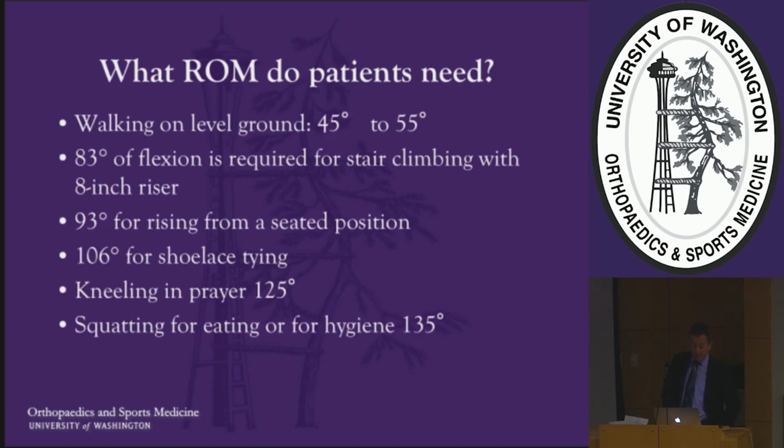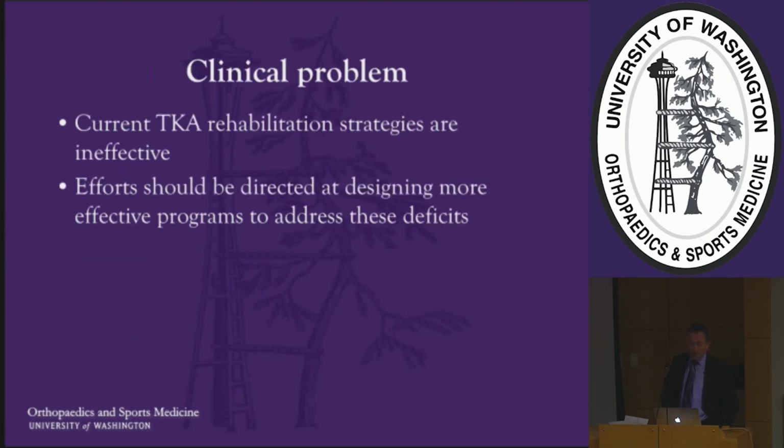Range of motion does make a difference in terms of activity, and that's a reason it's important to check. But the problem is that we don't know what patients are doing after they've left the hospital, and we don't know how to make their rehab effective. As a result, particularly because our hospital stays are now 2 days or less, we need to be concentrating on the other 88 days of that global period.